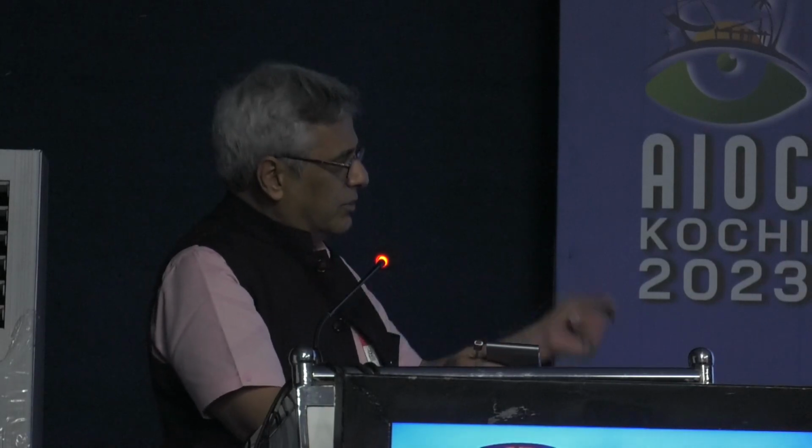Anti-VEGF is always given at the end only, because I'll give it when the last port is left, after 2 ports I have already closed. Just before the third port I'll give, because if I do it before, it may elute out.